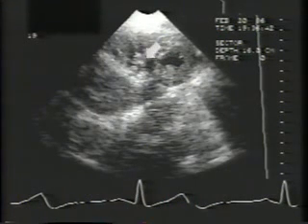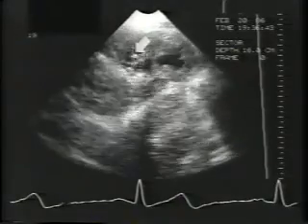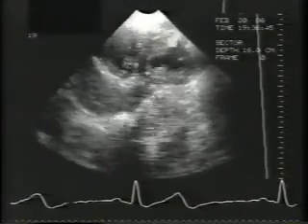The right ventricular apex is heavily trabeculated. Note the uniform contractility of the apical segments.